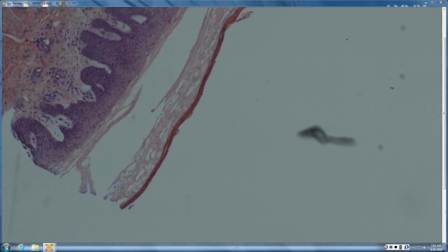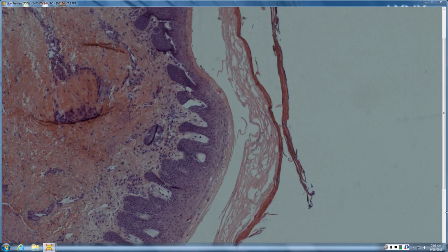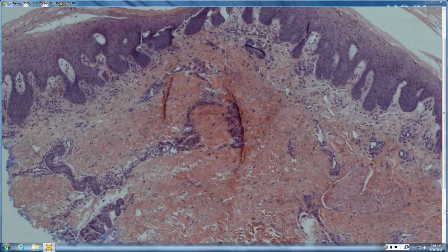Because that did look somewhat like acral skin, and maybe some of those were squared. This is kind of more of a subtle clue, but if you see acral skin and squared off vesicles, that is supposedly a little bit more indicative of true dyshidrotic eczema or pompholyx. But again, that's more like a derm path thing, I suppose.